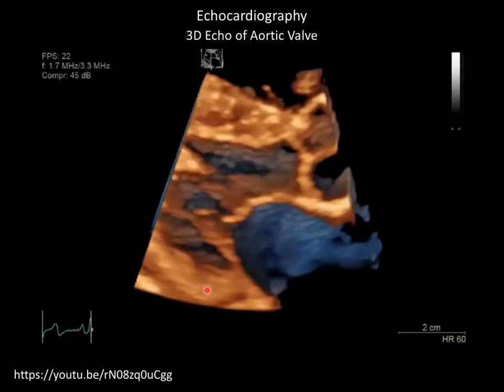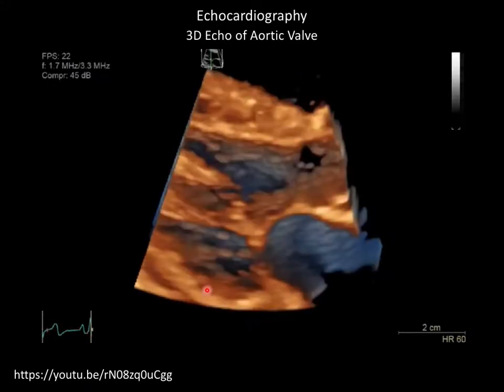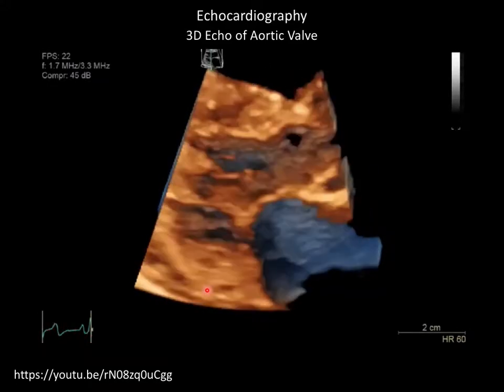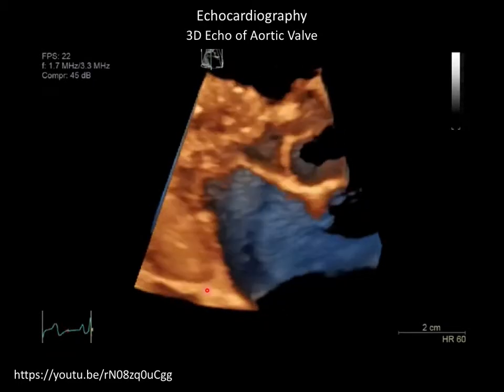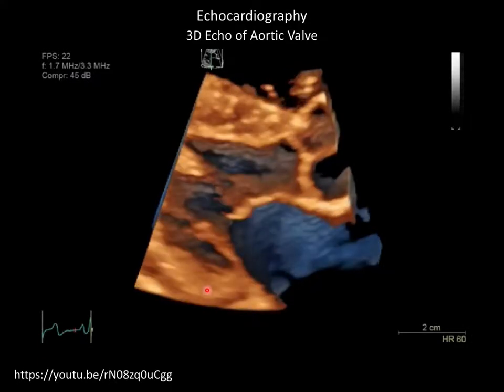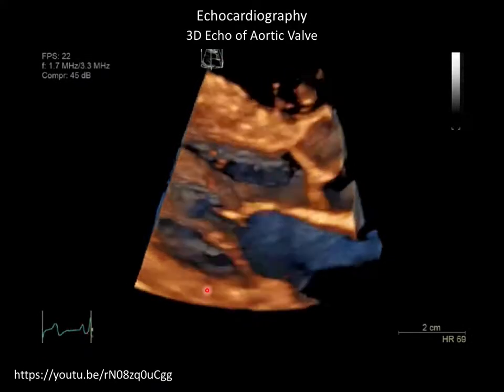And so you'll take 3 heartbeats, and you'll sample a section in heartbeat 1, another section in heartbeat 2, and another section in heartbeat 3, and paste all that together. Assume those 3 heartbeats provide identical motion, and look at that movie.